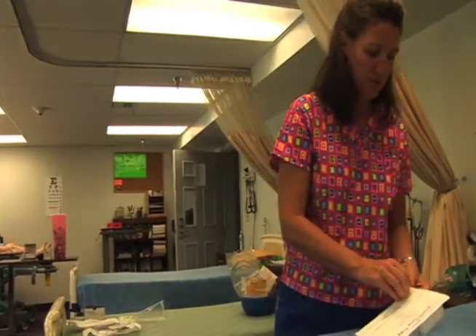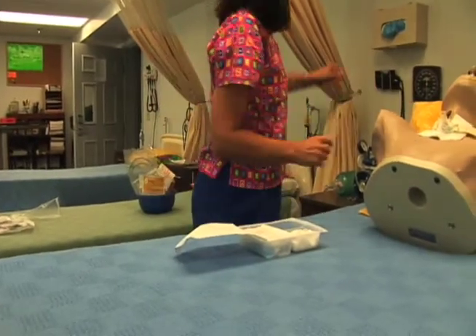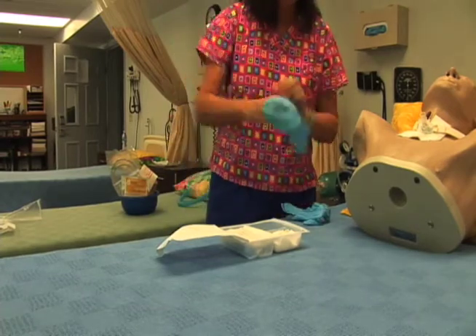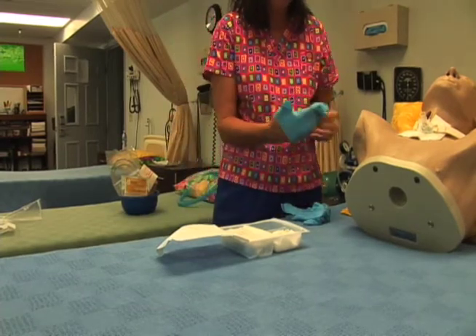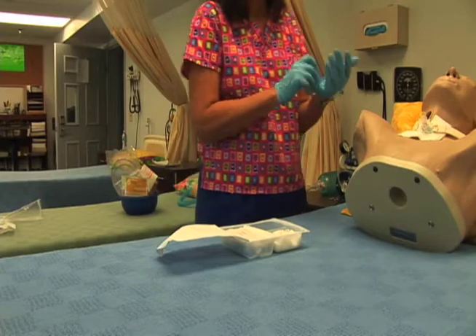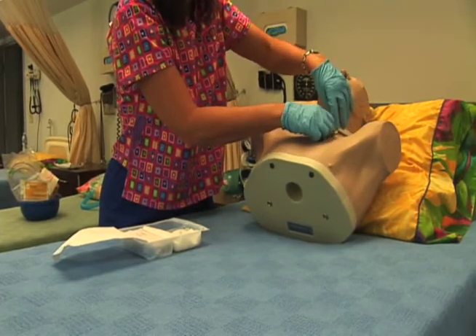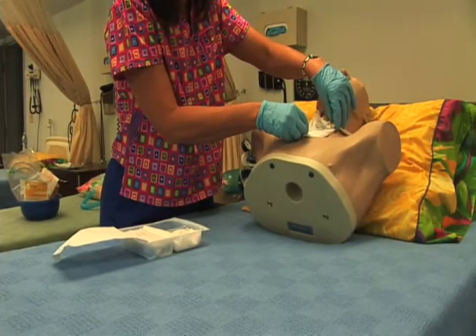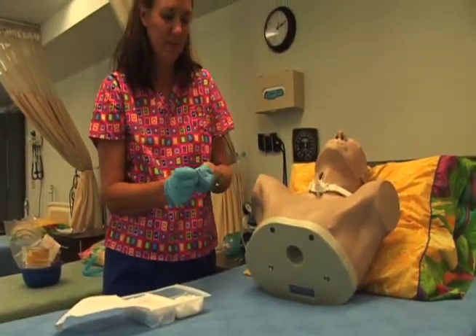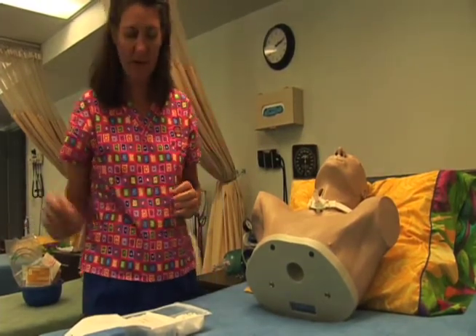Okay, now we're going to open this up, and at this point, to take the old dressing off, we can put on some non-sterile gloves. I don't have to put them on with sterile technique. I may need to loosen this Velcro, or I can just slide it right off. Sometimes the dressing is pretty clean and sometimes it's really messy. Once you finish that, put it in your hand and put it in your other hand like this, and throw it in the trash.